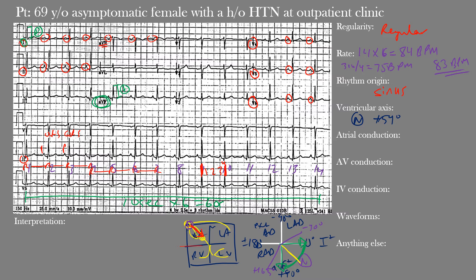For atrial conduction, we typically look at leads II and V1 for P-wave or atrial abnormalities. There are small biphasic P waves in lead V1, but the P waves are much easier to make out in lead II. The P-wave duration appears within normal limits — normally defined as less than 120 milliseconds or three small boxes. A prolonged P-wave duration suggests left atrial abnormality, since the terminal portion of the P wave represents left atrial depolarization. In this case it's normal, so we have normal atrial conduction.